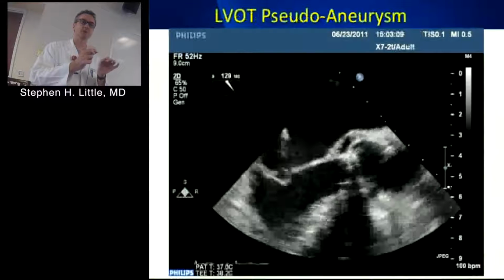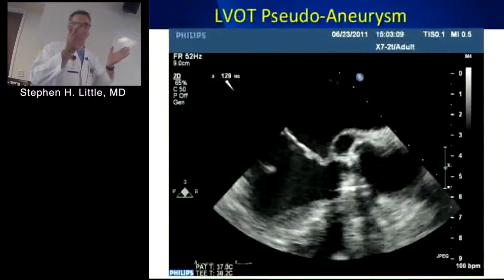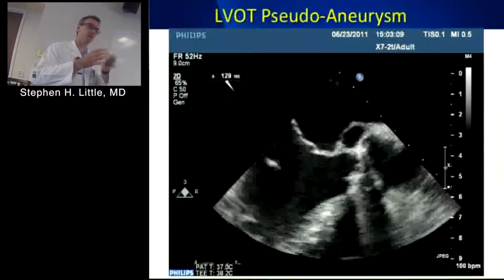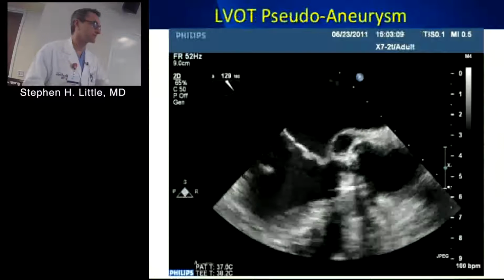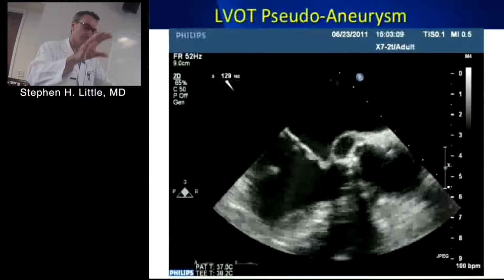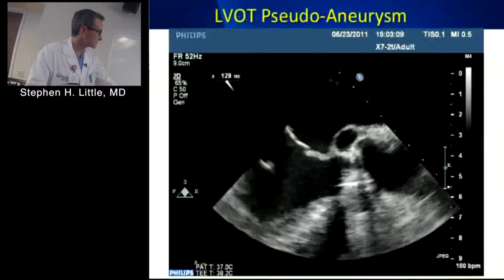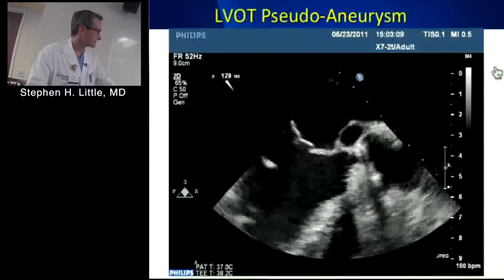As soon as it ruptures on one end, the pus is gone. The patient will have a fever for a little while because the pus hits the bloodstream. But basically now it's open at one end, so it's going to get pulsatile. The natural history is abscess, then typically pseudoaneurysm, meaning open at one end. And that's what you see here. That pulsatility is sort of the natural history.